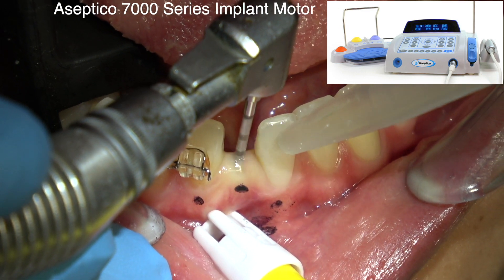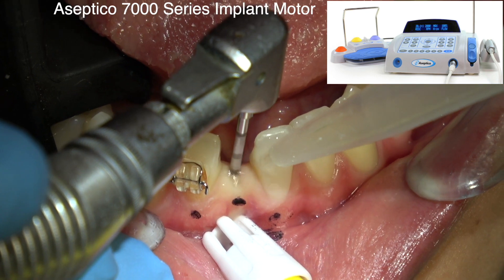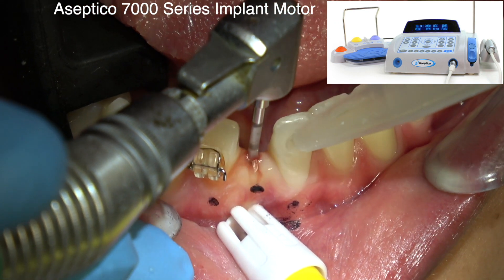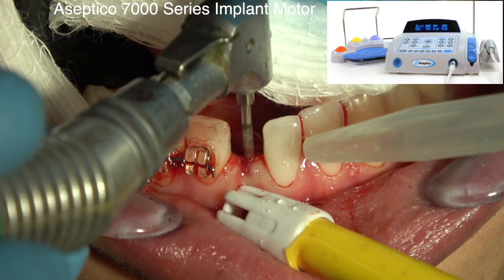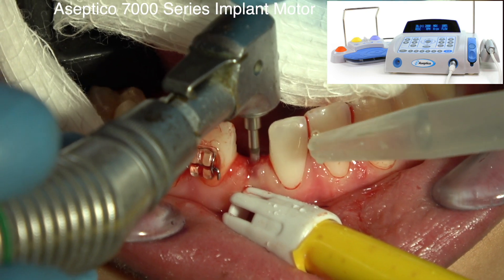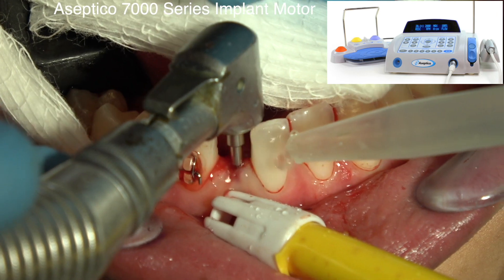The trick is keeping that drill parallel to these adjacent teeth, because I'd like to drill to depth and control the angulation. You can see I'm just a tiny bit to the lingual because I want as much bone as possible on the facial. So I've drilled to depth.